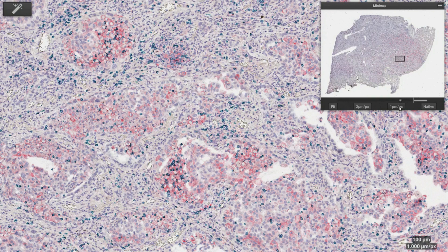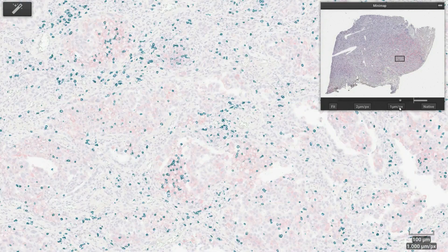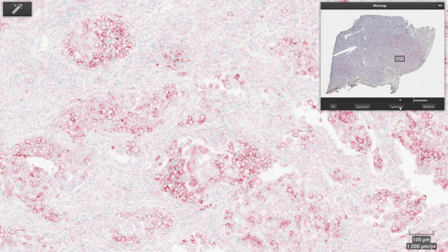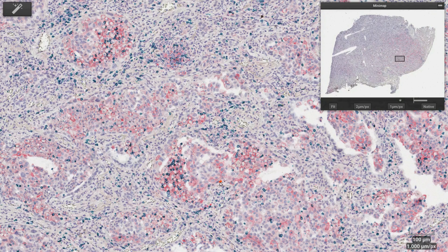Here we are looking at a non-small-cell lung carcinoma with IHC staining — CD8 in green and PD-L1 in red. A key component of the analysis is the use of machine learning for the proper classification of tumor cells versus cells in the tumor microenvironment.